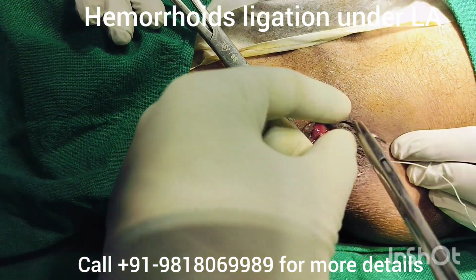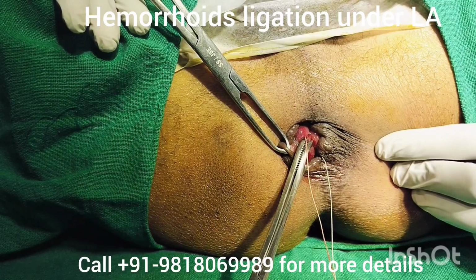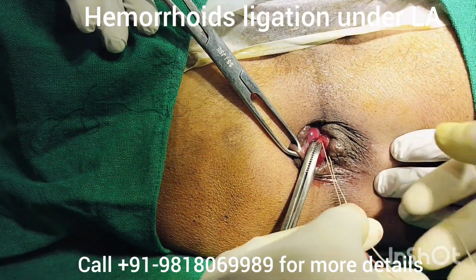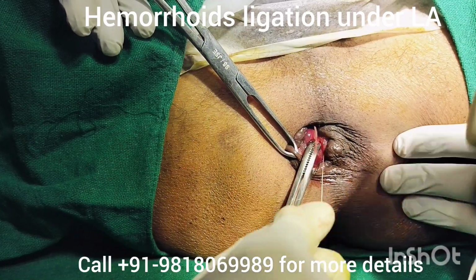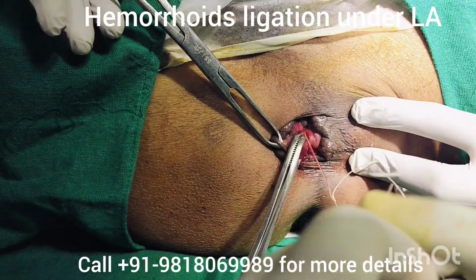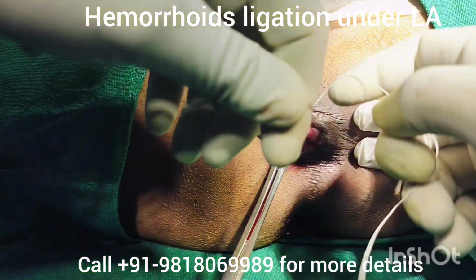And we will ligate it. First knot will be placed medially. This is first knot we are placing at the point of transfixation. We have ligated this pile mass.